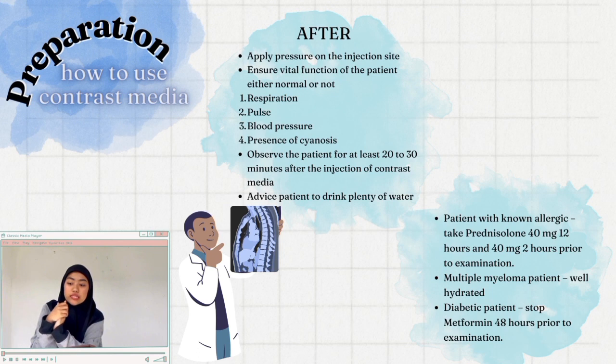And then we need to observe the patient for at least 20 to 30 minutes after the injection of contrast media, and then advise the patient to drink plenty of water.